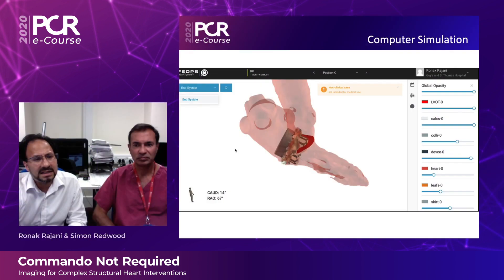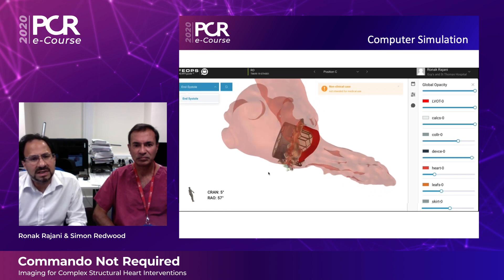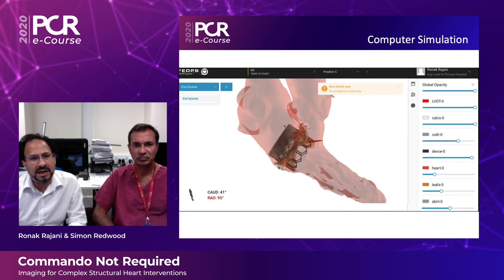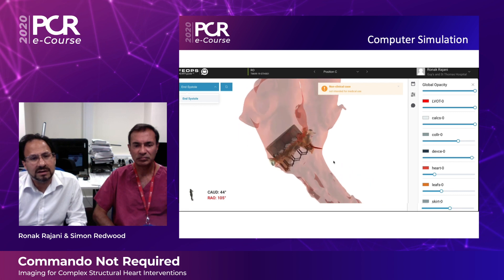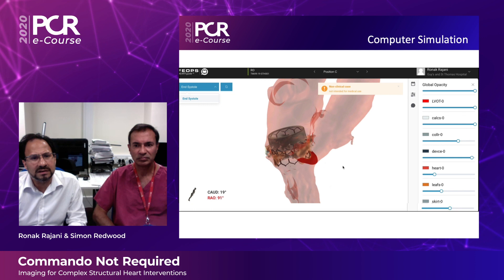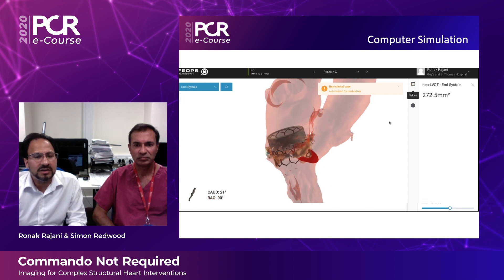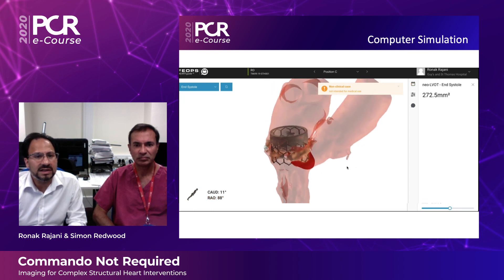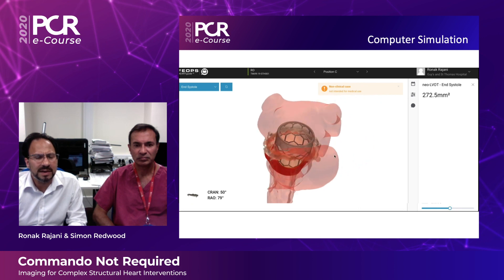Our next step would be to use finite element modeling, which is a technique based on computer simulation able to model the mitral valve annulus, the mitral valve leaflets, the chordae tendineae, and the papillary muscles. The advantage of this technique is that it's able to account for various different tissue properties and to look for calcium deformation.